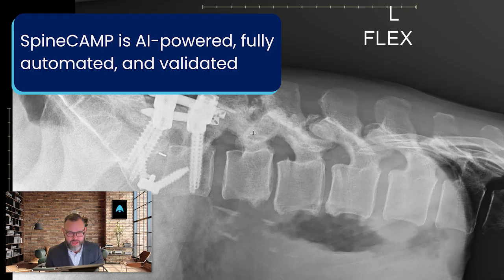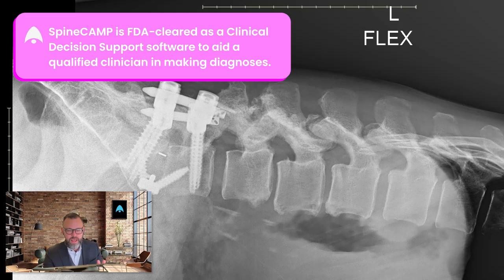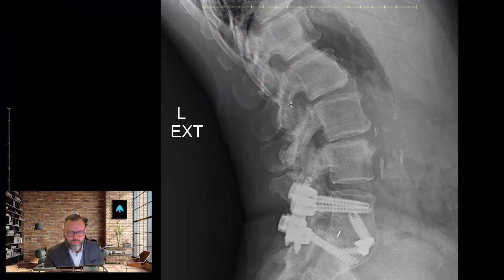Nothing ever happens with that. Where we have errors is in x-ray physics or patient positioning. And you can see here clearly that she's bending all at the hip, right? This is pretty straight across. All of the motion is at the hip, but it is what it is. And SpineCAMP, luckily, helps to sort this stuff out when we have these little problems. You could see when she went to bend backward, not much motion at all. All these billowy visual findings here are all a degenerative change in arthritis.